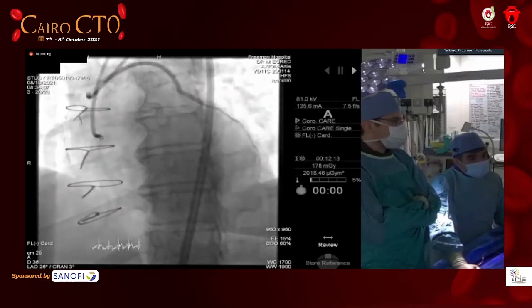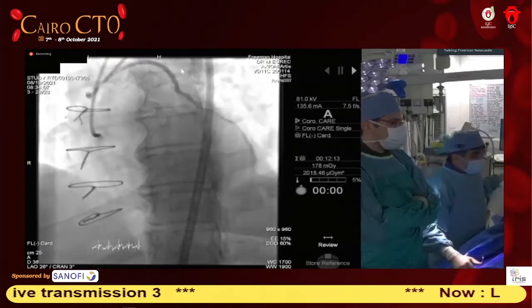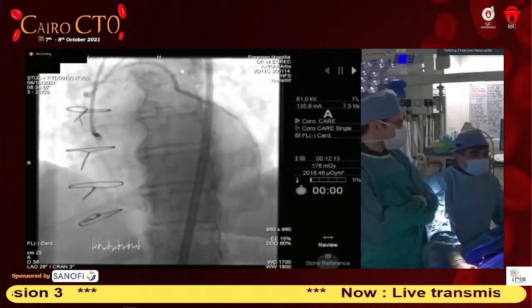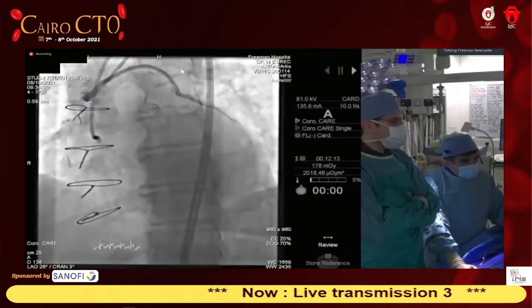Absolutely, and the thing is, she was completely asymptomatic. Obviously, we've sedated her and given her some painkillers, but she was asymptomatic. This was the first shot, so this didn't happen overnight. So she came with this. So next one. So now the strategy changed.